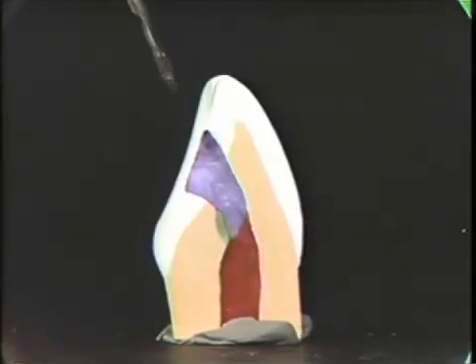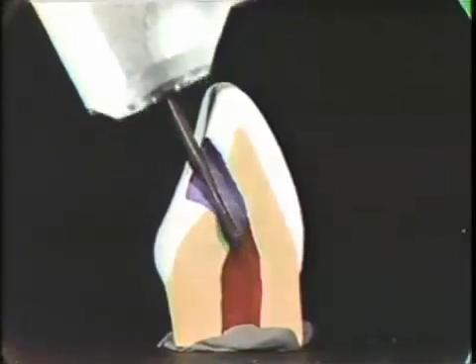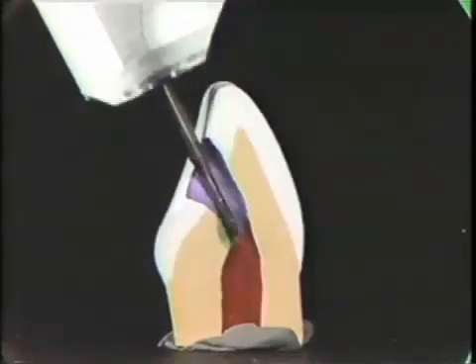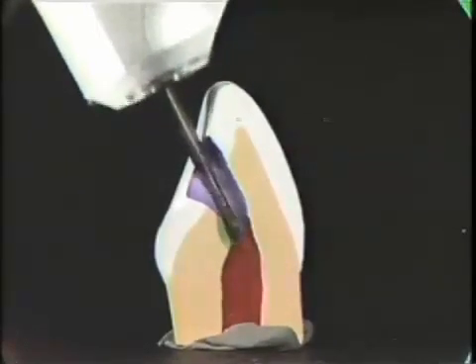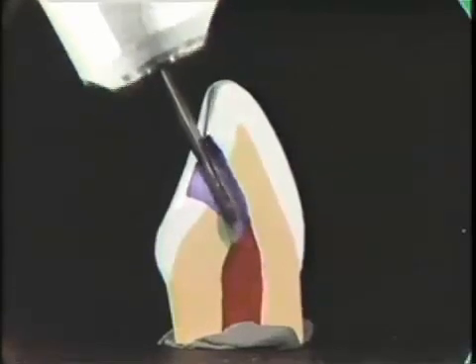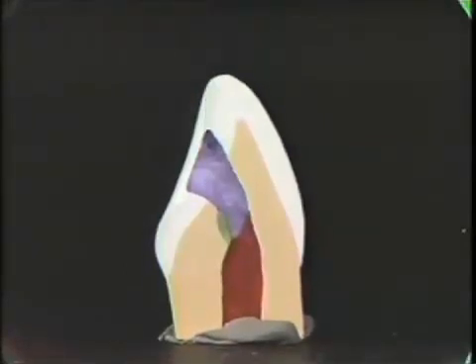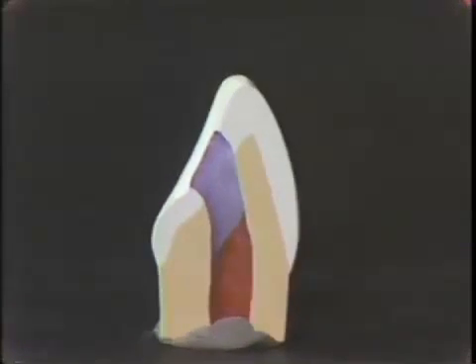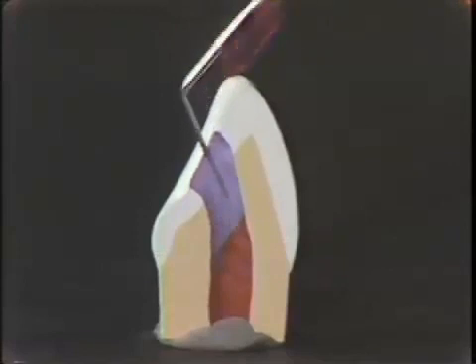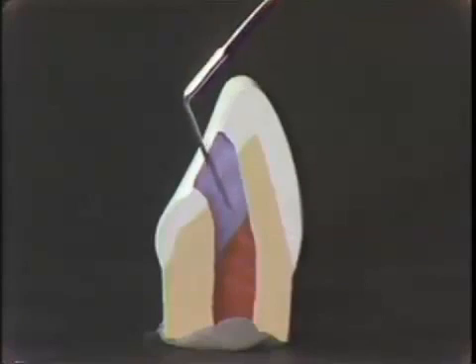Then with the surgical length, flame-shaped burr, we enter into the pulp chamber and smooth the walls and flare the walls of our access preparation. This is a very inefficient cutting instrument, so you have lots of control to completely smooth and flare the walls. Once this is done, your preparation should be complete. All that's necessary is to check and make sure that the roof has been completely removed, that you have access, that you've not gouged the tooth, and that you fulfill all of the requirements for a properly designed access preparation.